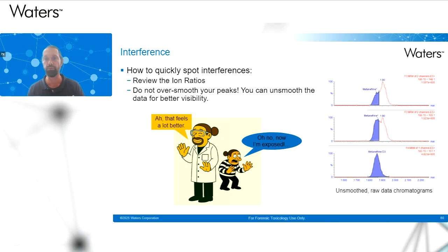But please don't overdo it because you might miss a possible interference in your data. So in this case, we are looking at unsmoothed data, and I think the interference is showing up much more nicely. Also, Martin is now a lot more happy with the interference nicely separated.